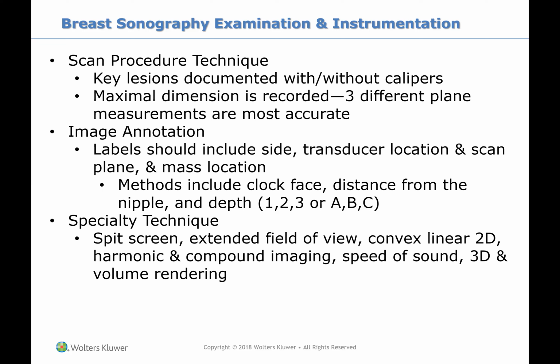Different people have different ways of imaging, so that'll depend on where you are. But how I usually did it was: right breast, and then I'll show you the clock that we use. Right breast, 2 o'clock, 5 centimeters away from the nipple, or 4, so you're documenting exactly where it is. And there are other methods, like depth or distance from nipple.